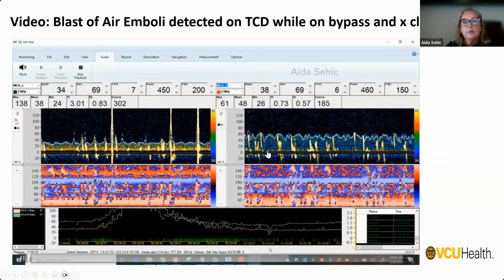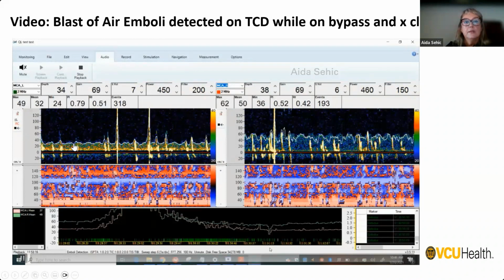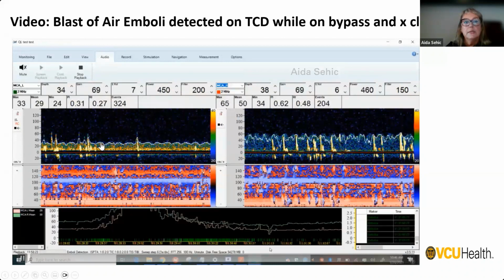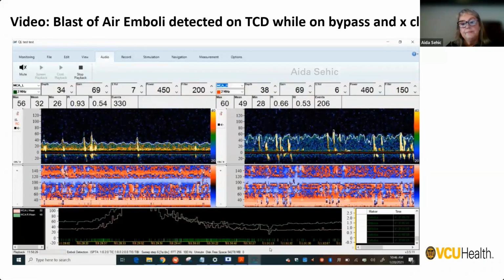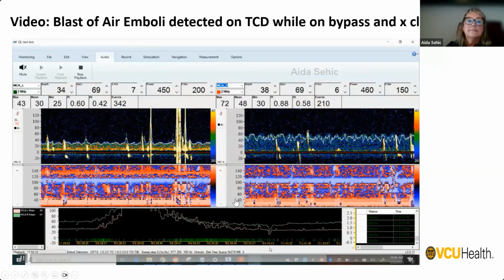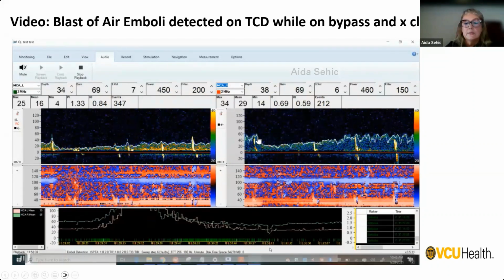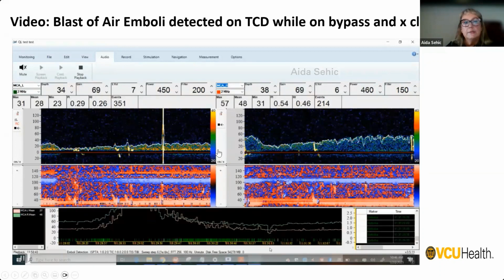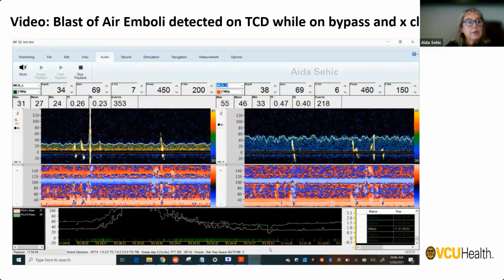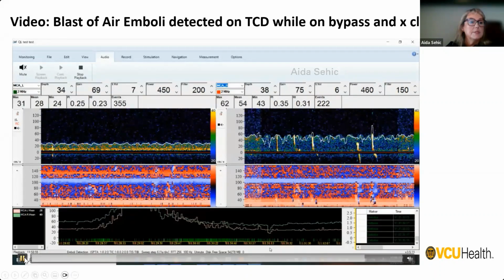Where pump flow will be reduced. Just few more emboli going through with this temporary tightening. And here is a reduction of the flow for final tightening. Source of emboli has been eliminated, so procedure can be continued safely.